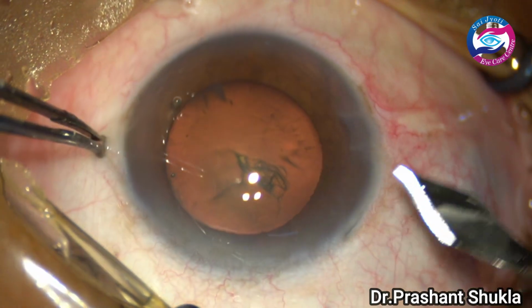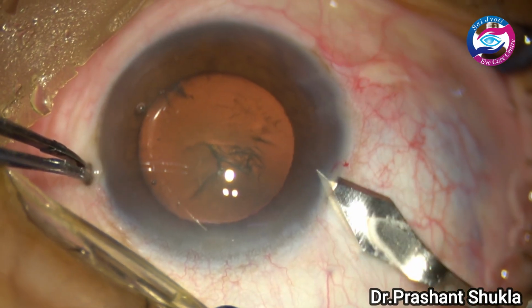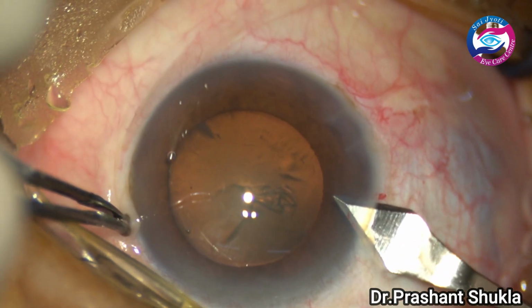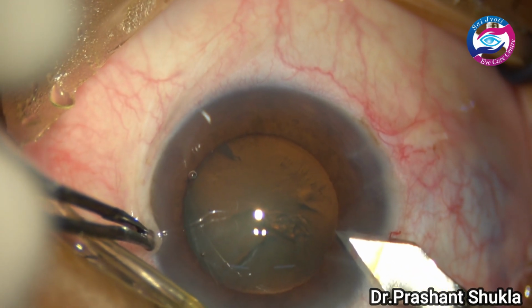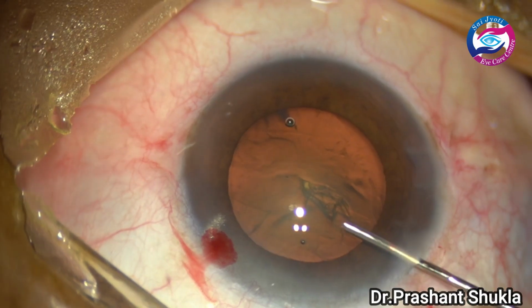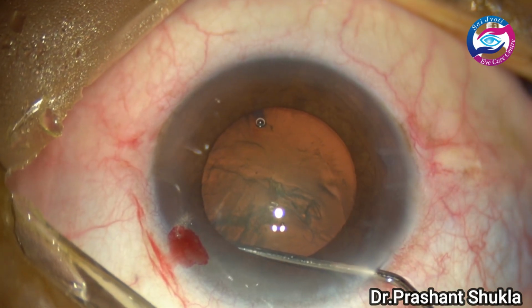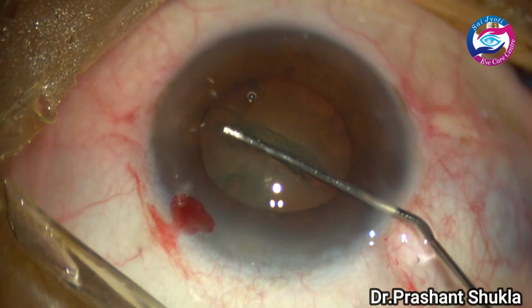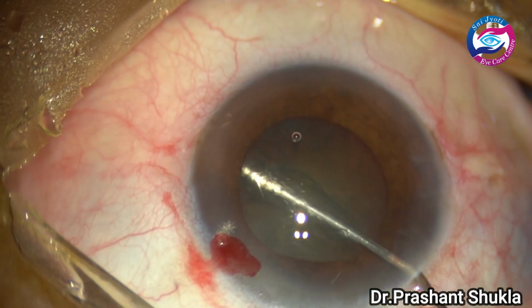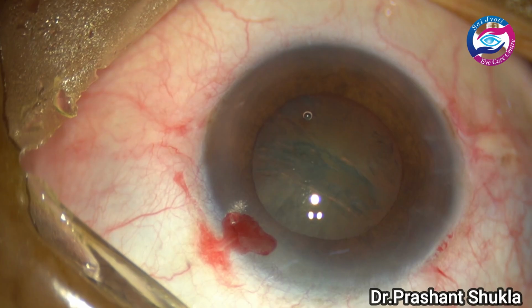So here I am making the main port, 2.8, using a steel keratome. This would be a triplanar incision. Hydrodissection has been done, and I could see a very good fluid wave moving across. The nucleus is tapped and the mobility of the nucleus is confirmed.